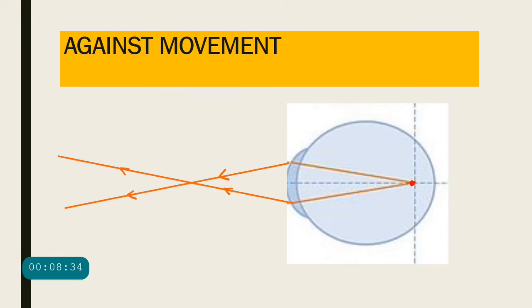So you can actually sit at the far point of the myope. So what happens if you sit at the far point of the myope? If you sit somewhere here at the far point of myope, all the light rays which are coming will actually fall in your eye, and you will not have any streak or any reflex. You will actually have a full, fully illuminated reflex, which is called the neutralization point.